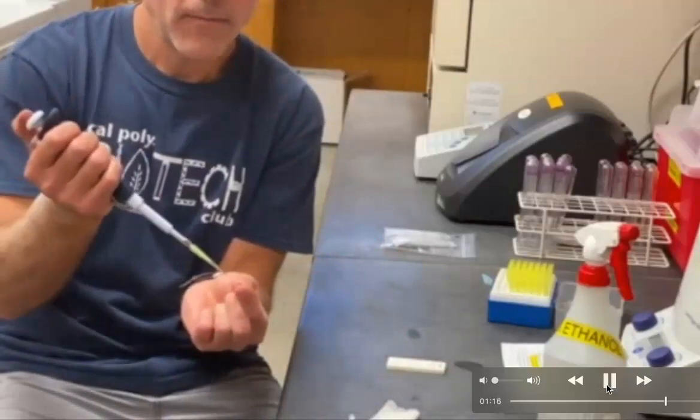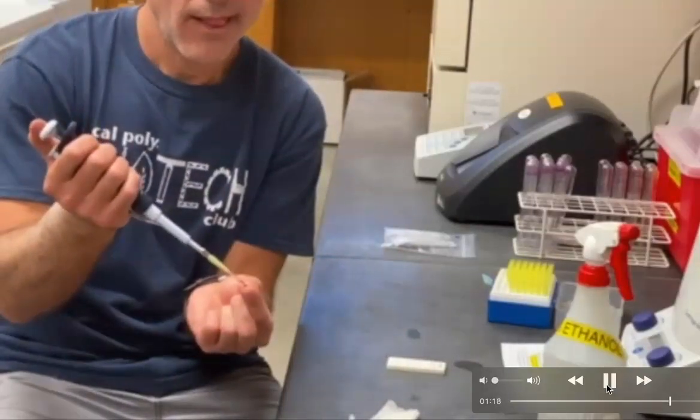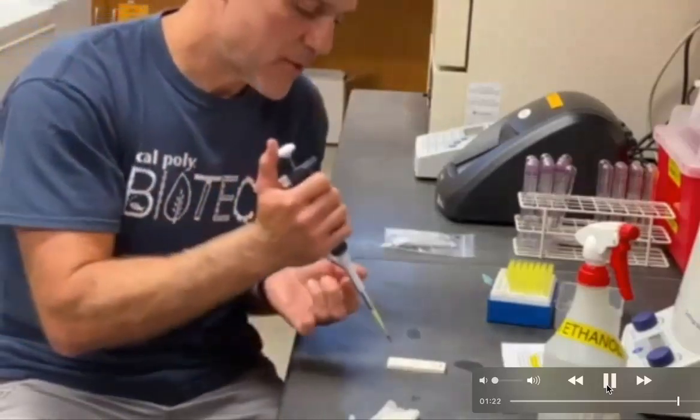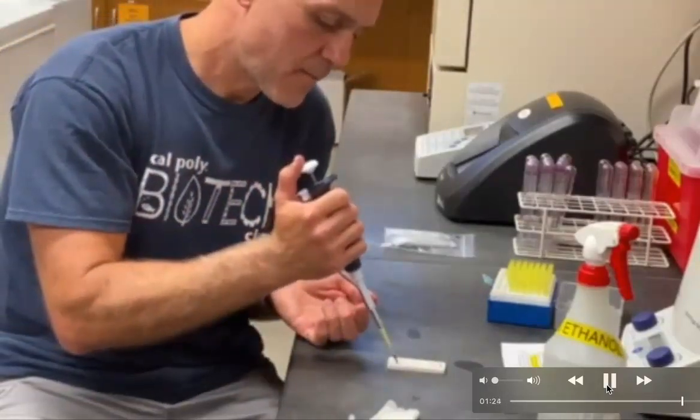Let's draw a second sample for the IgG well. So IgG and IgM are just two kinds of antibodies that you would produce. Typically IgM comes first, and then your body produces the more specific IgG, usually after a week or so following initial infection.